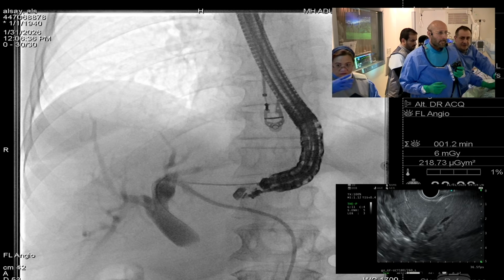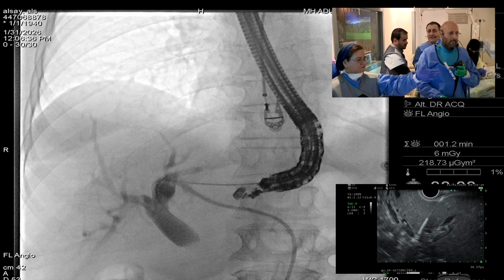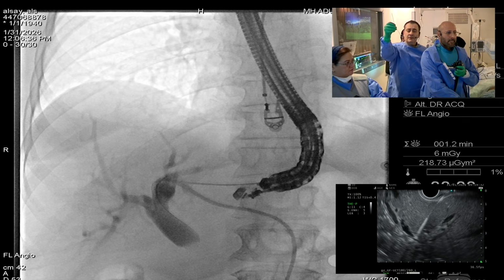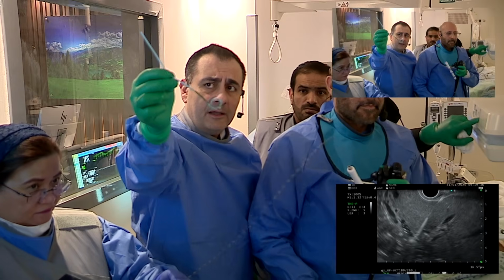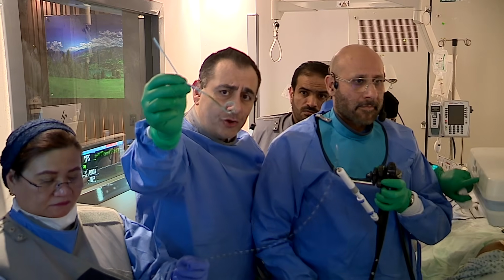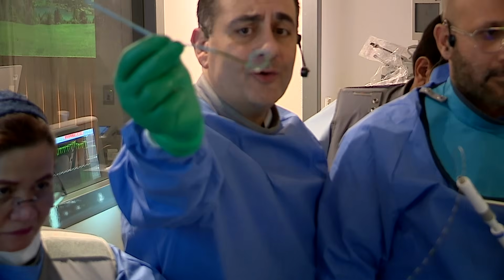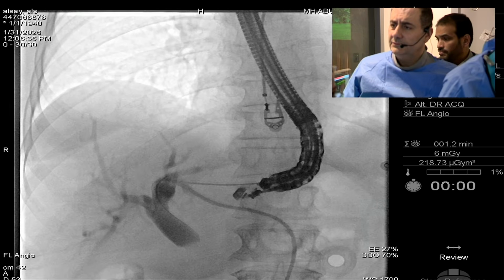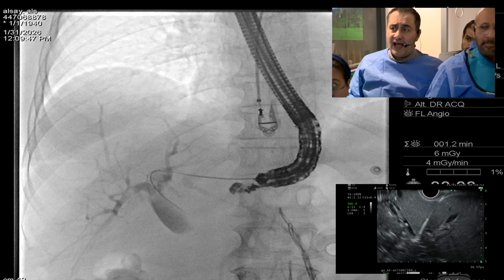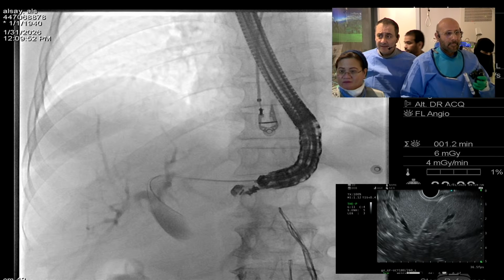Okay. X-ray. Where's the camera? X-ray? Yes. Can you zoom on the pigtail? I see. So when you cut the distal end of the catheter, you unravel the perc drain and you can remove it. X-ray, please. Now let's do X-ray. So you see now we have the wire buckled on itself for safety through the needle.